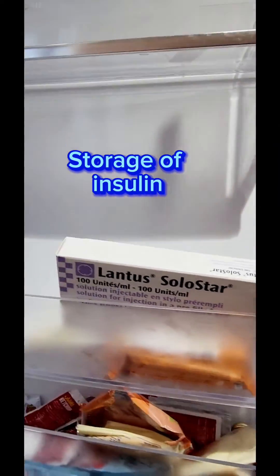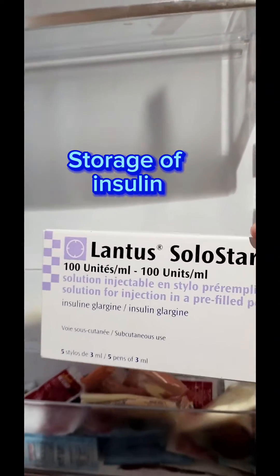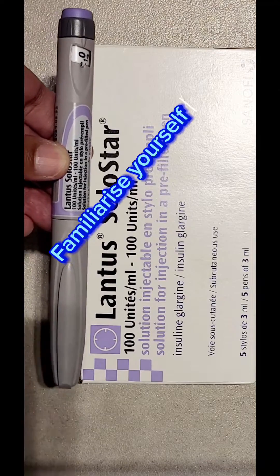Let's look at some of the steps for insulin usage. First of all, storage. Insulin is stored in the refrigerator. Take it out of the fridge and leave it at room temperature for 10 minutes.